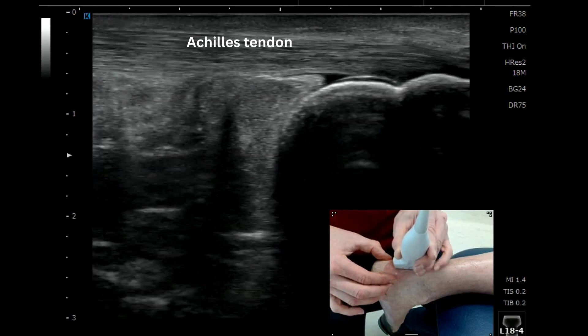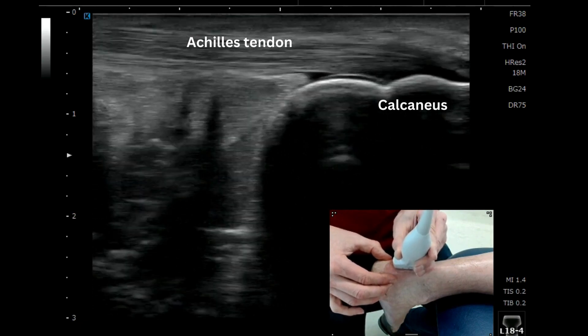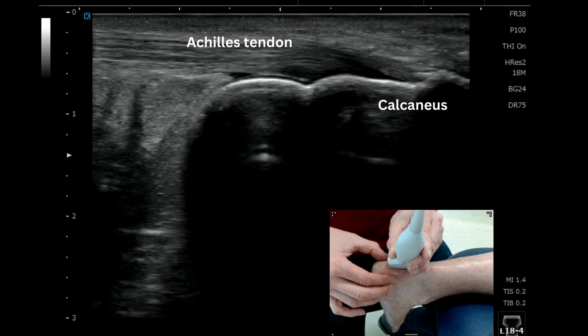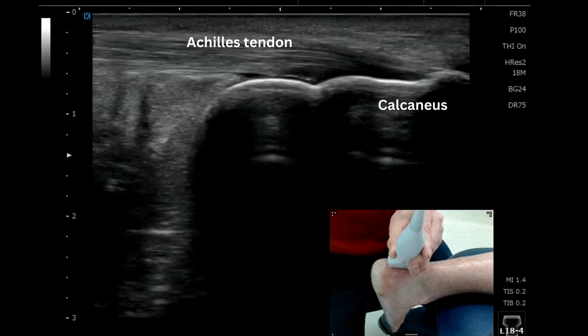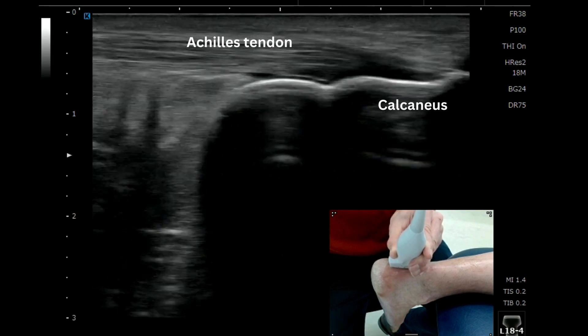You'll start to see that very clear, distinct appearance of the tendon attaching onto the bright white calcaneus.